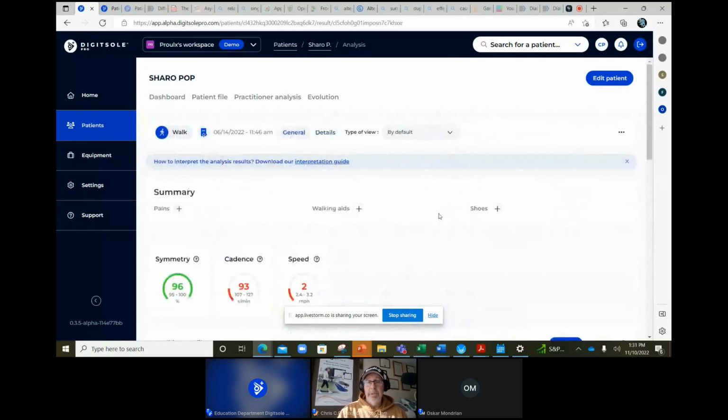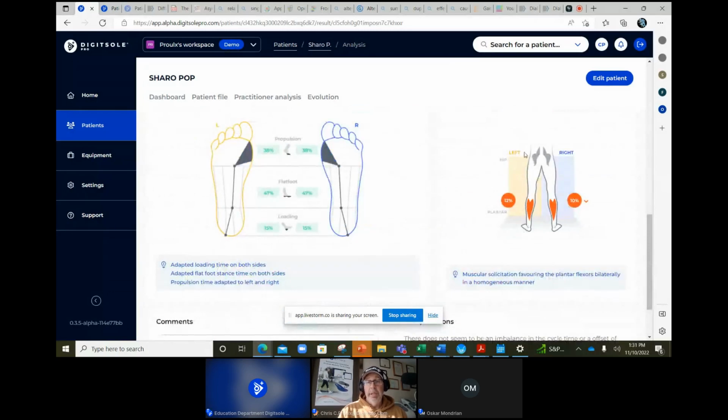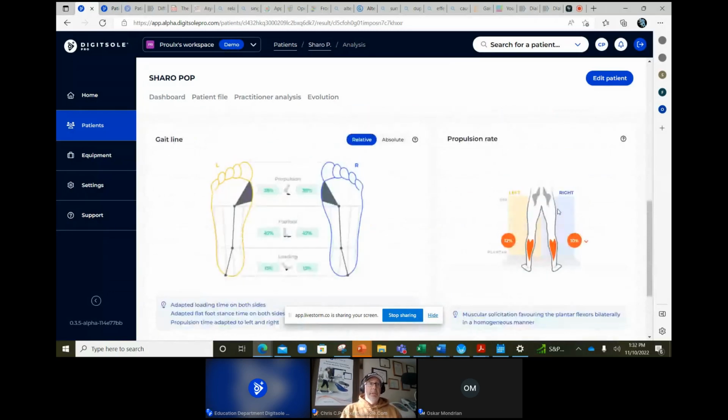So that was foot position. And then we see this over here, and that was the propulsion rate. So what am I getting at here? Well, whether or not it's the foot position that started it, whatever's going on, it seemed to be part of the answer to the question of why she's not using her hip flexors and has some low core stability.